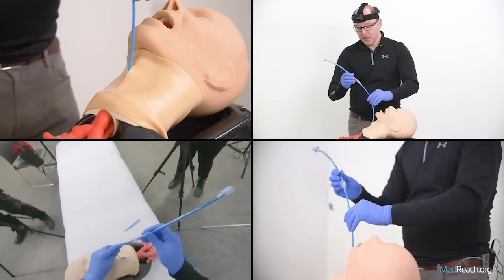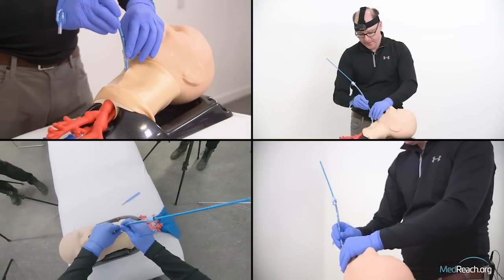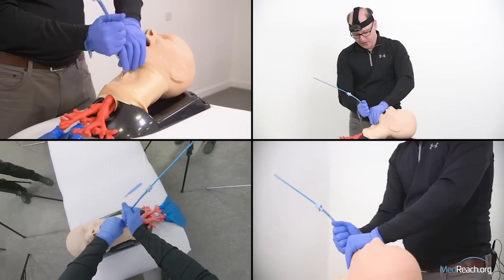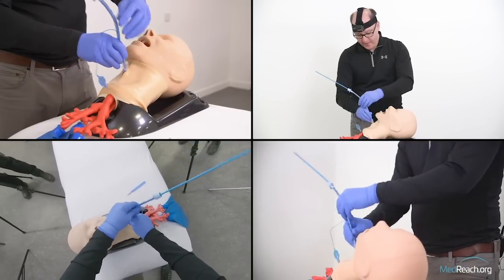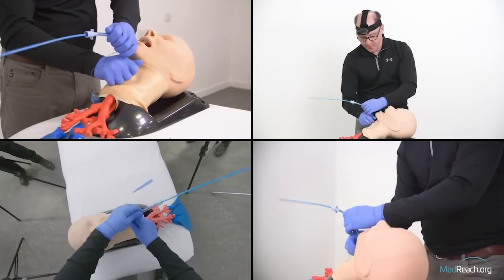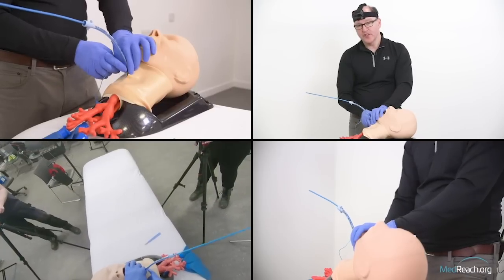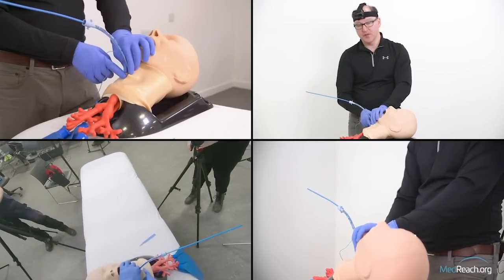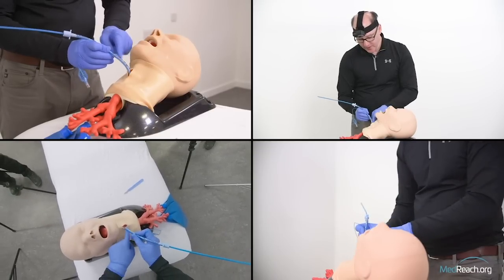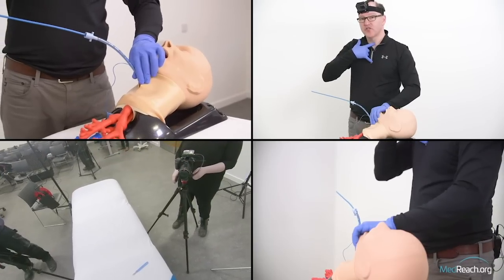In terms of sequence, it's important to go scalpel, finger, then bougie or tube. If you don't do scalpel-finger-bougie, the hole may not be big enough to accept the tracheal tube. On placement, at 16 centimeters the cuff has disappeared and we're already below the cords — it's only 11 centimeters from cords to carina, so don't over-insert.